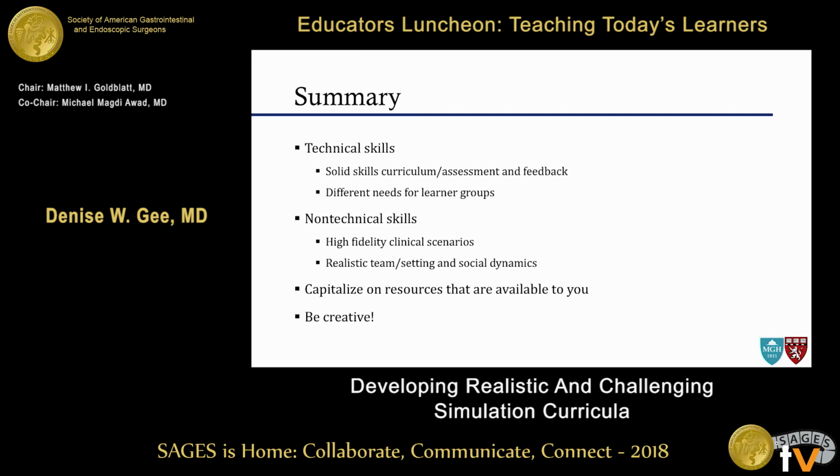Capitalize on the resources that are available to you. If you don't have a VR simulator, lap box trainers work just as well. And also be creative and collaborate with people in order to come up with new ideas for what your learners may need.